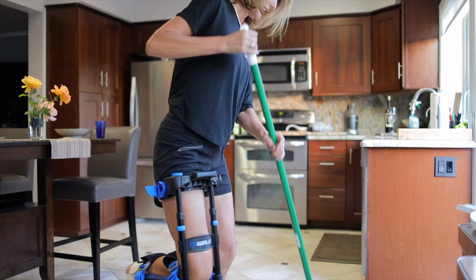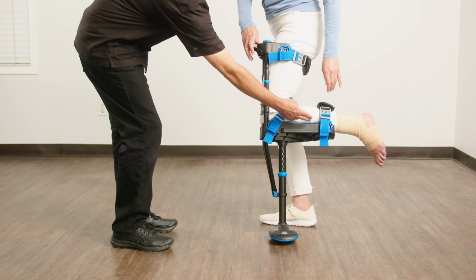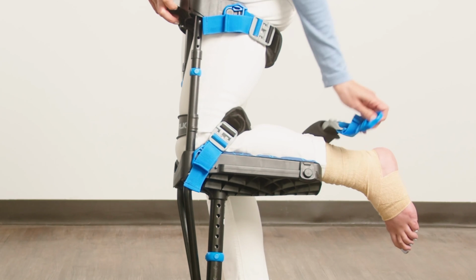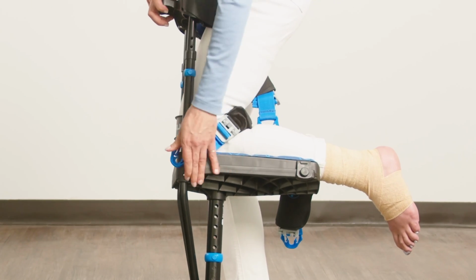Other skills. Now that you have your patient walking proficiently, it's time to teach them to handle these common everyday situations. Donning and doffing. The average patient will don and doff the iWALK 10 to 20 times per day, so let's teach them how. To remove the crutch, have the patient release the strap tension. Then remove the blue buckle. Start with the calf strap, then the upper thigh strap, and finally the knee strap.